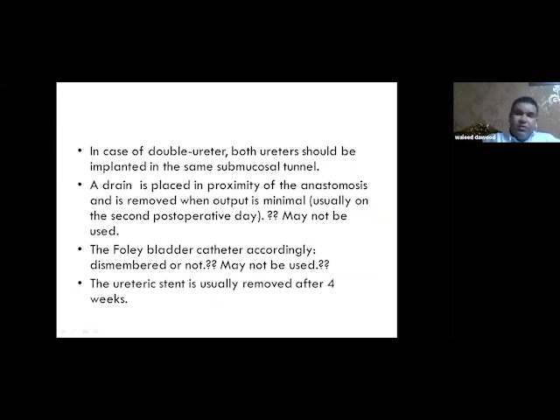in case of dismembered anastomosis. But if the ureter is still intact, we cannot put a drain, and we can also omit putting a urethral catheter in non-toilet trained children, children 1 year or less when we do Lich-Gregoir unilateral. If there is no mucosal injury at all of the bladder, we can finish the operation without putting a retrovesical or paravesical drain or urethral catheter. The Foley catheter can be used for 5 days if we did dismembered anastomosis.